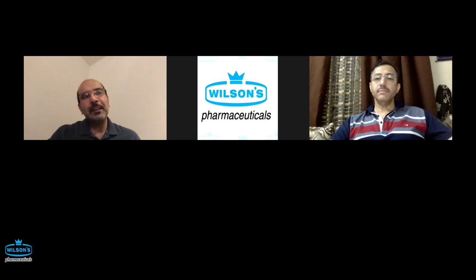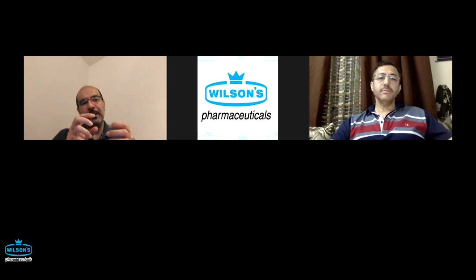Once you're there, though, that's the tricky part, because with the Pentax, that's a longer, stiffer shaft, and you have to be very careful there. I generally like to use my big wheel up and then small wheel to the right, and maneuver the tip with the scope dials, and then gently advance the scope.